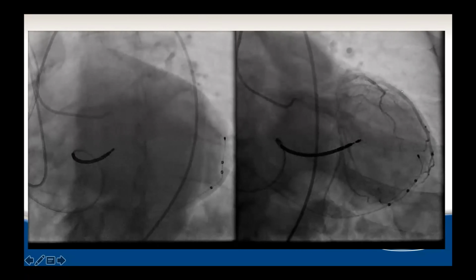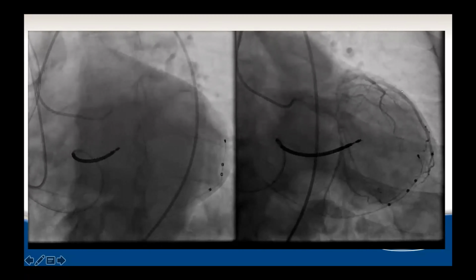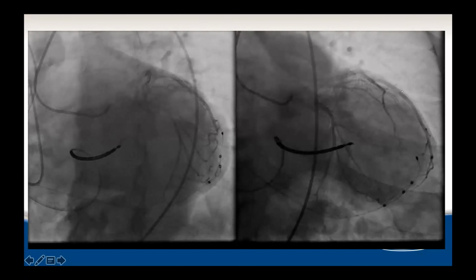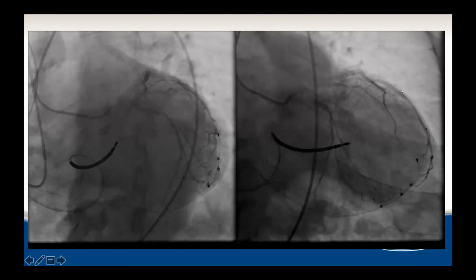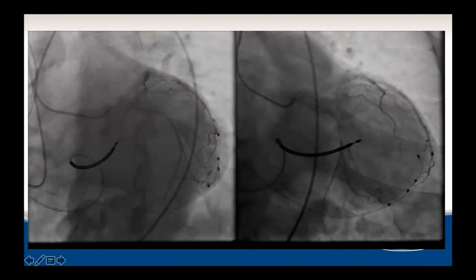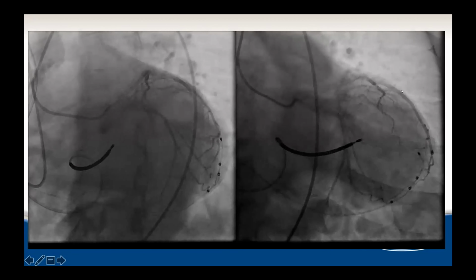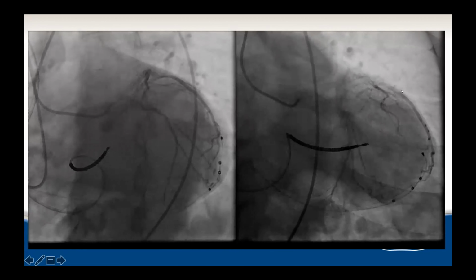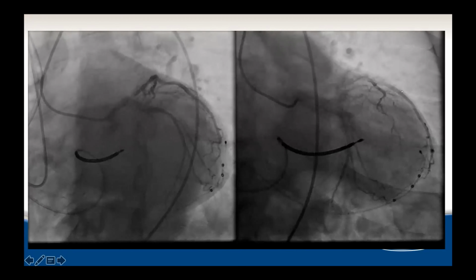But I think just like the other cases, the imaging is where you make your final decisions. So going into this type of case, I have a plan A and a plan B, but I would expect that the circ is diseased enough that I'm going to be treating that. And because of the angles, I'm going to worry about getting adequate prep and maybe stenting from the left main, from the circ back into the left main, just because you're recrossing and everything into the LAD is going to be good. If it's really severe, to the point where you're worried about stent fracture or a big problem there, then you might avoid that. But I think it's harder to get a perfect result in the circ as well.